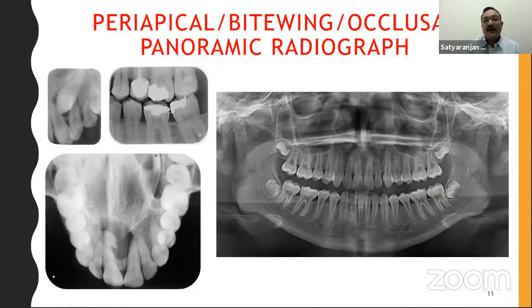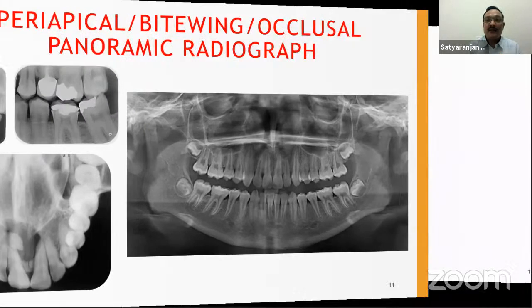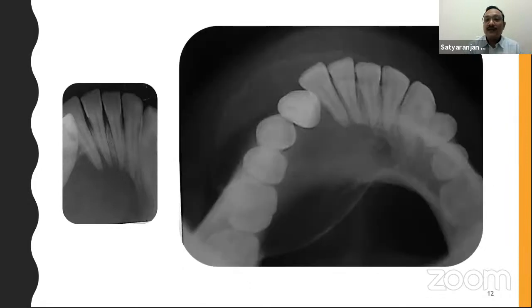Now, we all know the common radiographs that we use are the periapical radiograph and the panoramic radiograph for that matter. Especially in the times of pandemic, intraoral radiography was most often not done because of the infection issue. So people used to be advised either a panoramic radiograph or a CBCT. Now that has its own disadvantages, because a panoramic radiograph has some amount of magnification. Bitewing and occlusal are also important radiographs that maybe are not very often practiced in dental clinics, but they are actually of quite some use. Now, if you have a bigger pathology and you need to know about the buccolingual dimensions, then the occlusal radiograph is the one which is required, as seen in this picture.